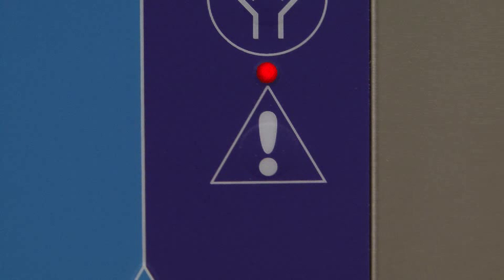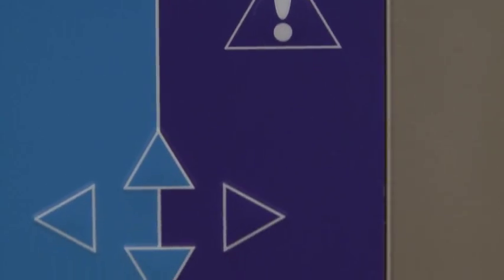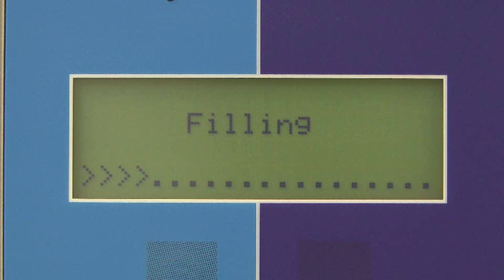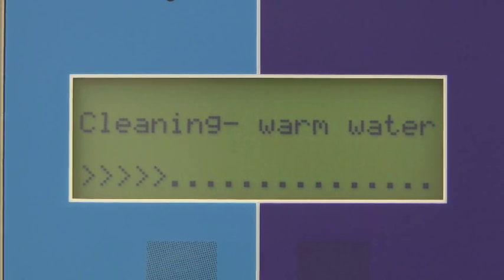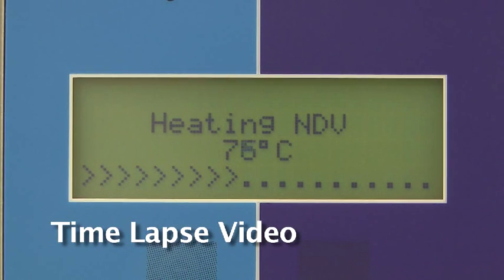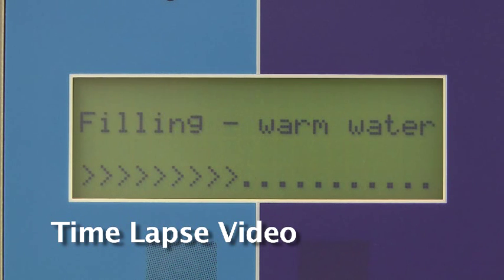The button in the triangle is the alert button. It highlights red if the detergent or softener rinse agent run dry or if there is another error message. The little directional arrow buttons are for use by FMO technicians only. You can see what stage the machine is at in the display panel — the small arrows show the progress. The door opening functions are locked while the machine is cycling so you cannot accidentally open the door.